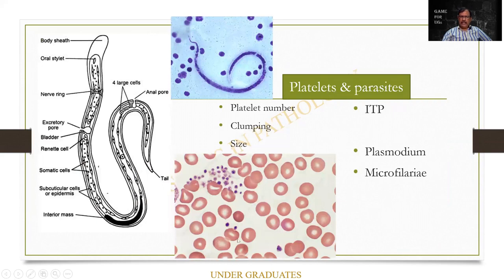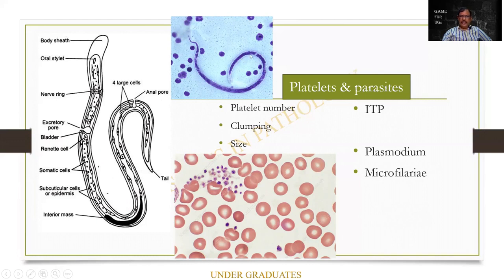Platelets and parasites — platelets measure 1 to 2 microns and can be seen in clusters, somewhat pinkish-gray in color. Parasites — this is the microfilaria, more important in microbiology. It has a blunt head, a sheath, and a sharp tail. The tail end is free of nuclei. All the dark dots are called nuclei. The other structures can be read in parasitology — this can be kept for the spotter in the examination. The importance of platelets: ITP can be kept as a chart. Plasmodium malaria — vivax or falciparum — can be focused. Microfilaria is again a slide for you.